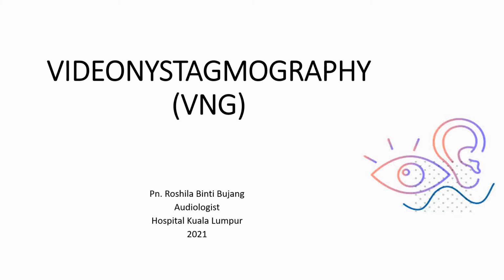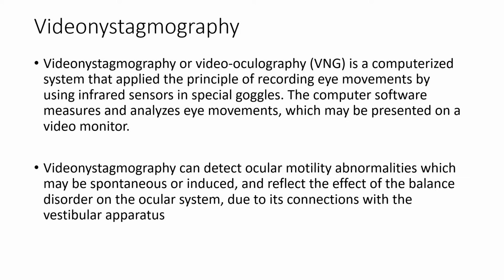So this is my recorded version of presentation about video nystagmography. I'm Puan Roshila binti Bujang, audiologist from Hospital Kuala Lumpur. Video nystagmography or VNG is a complete diagnostic system for recording, analyzing, and reporting eye movements by using video imaging technology, which video goggles with infrared cameras are used.